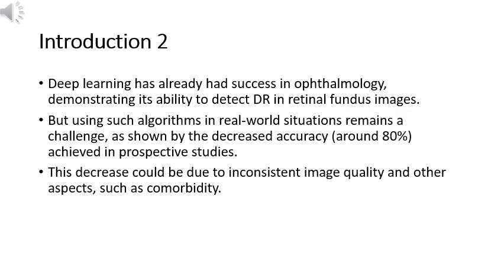In a near future we expect AI could assist our specialists in achieving levels of consistency and accuracy beyond unassisted human abilities. This study aims to evaluate the capacity of AI methods for solving several tasks related to our CADx pipeline. We automatically discard inputs that are not derived from color fundus photography, CFP.